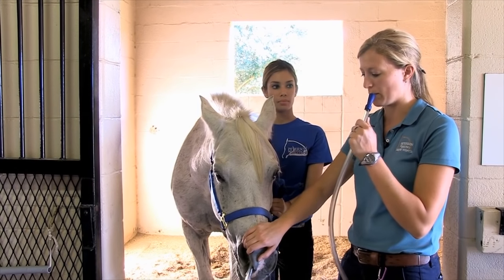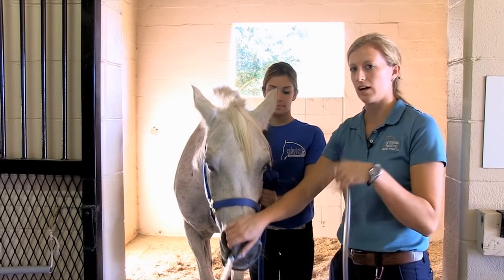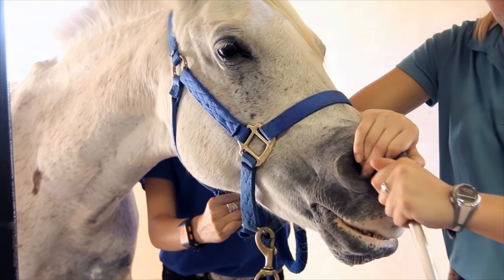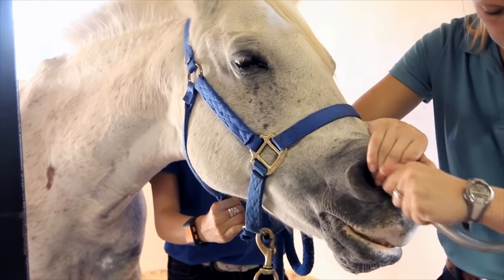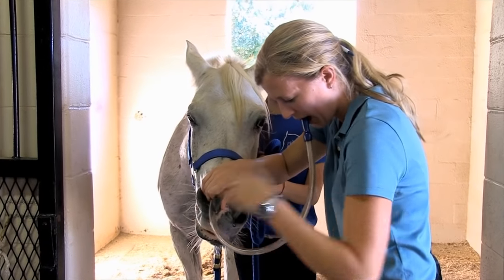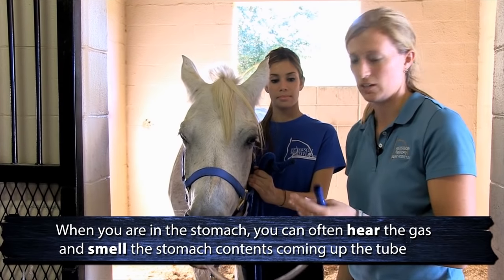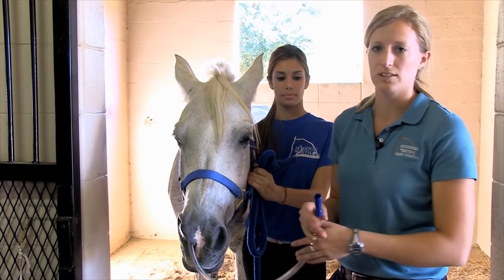I hold the tube in my mouth and blow on it as I pass it down to help open up the esophagus, and you can tell when you're into the stomach. Now I'm in the stomach — you can often hear the gas and you can smell that it definitely smells like stomach contents. Now that we're in the stomach we have all the signs that we should be in the stomach and not in the trachea.